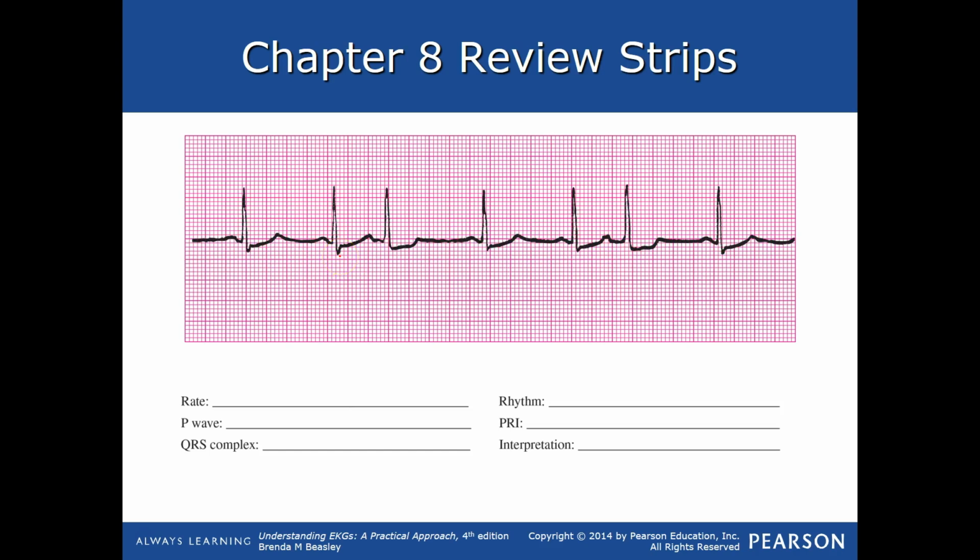Moving on up. Let's see what we got here. We got P waves. That's a P wave. This guy right here, he's early, isn't he? He looks a little different. So let's go ahead and look for his P waves. We can see what normal P waves look like. That might be a little bitty P wave, or it could just be absolutely missing. So let's keep moving here. This looks pretty normal.